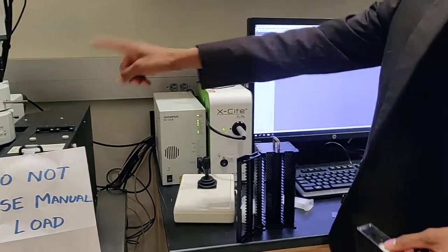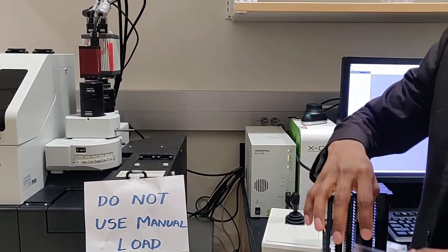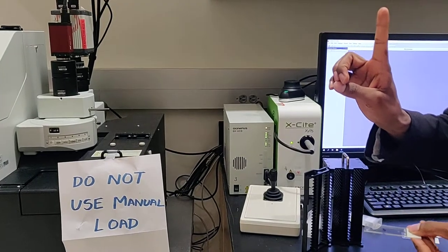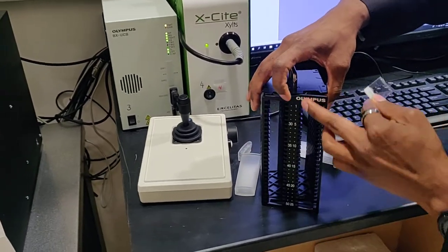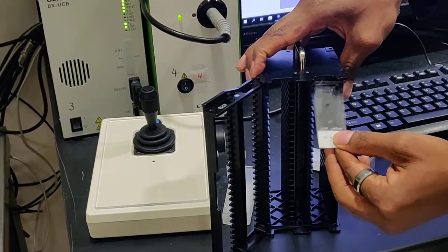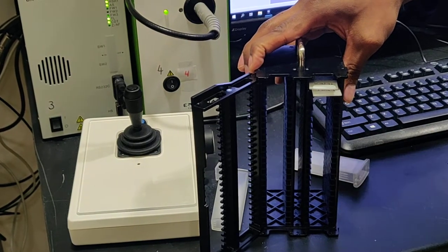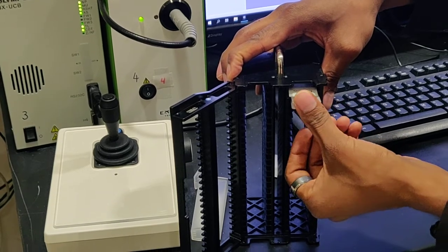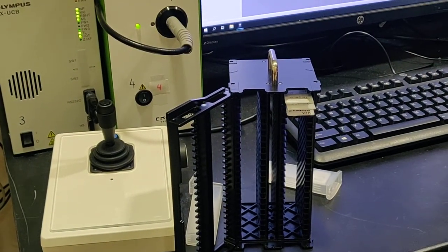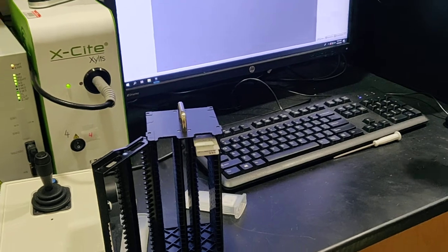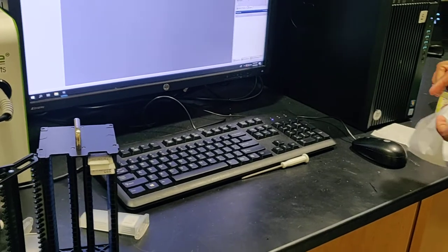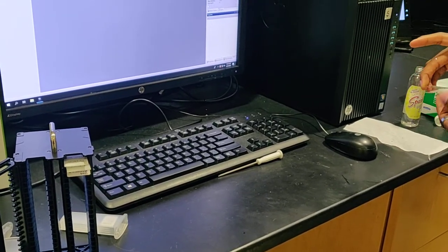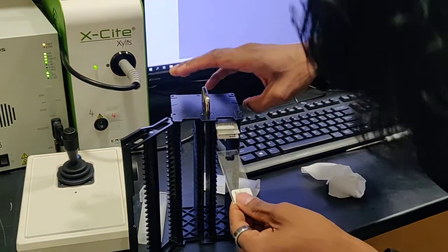Now because this is an upright microscope, the light comes from top. Hence, you would like to place the sample in such a way that the coverslip is pointing up and the label is pointing out. You can see from 1 till 50 in the cassette box. Slide number 1, 2, and 3. This third slide feels a little dirty, so I will just clean it up a little bit.